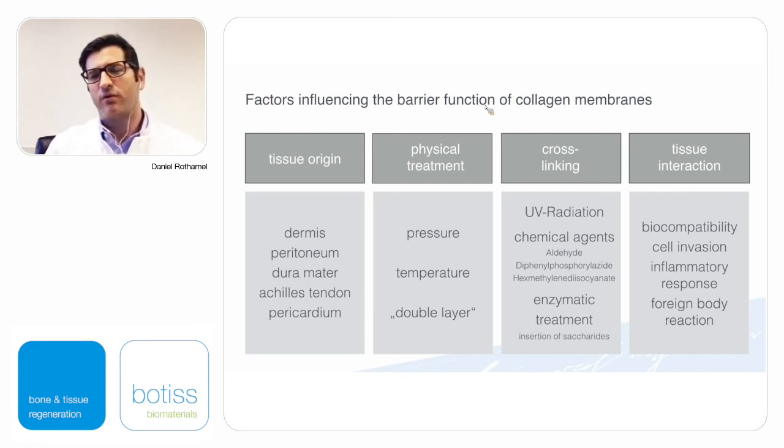And the inflammatory response: when we induce a foreign body reaction, then we are seeing a much faster absorption because we have more cells that are interested in absorbing the membrane material. But also we are seeing a compromised healing sometimes because more foreign body reaction will end up in more inflammatory response that ends up in more swelling and compromised healing.